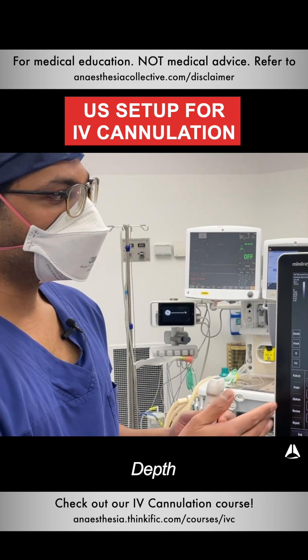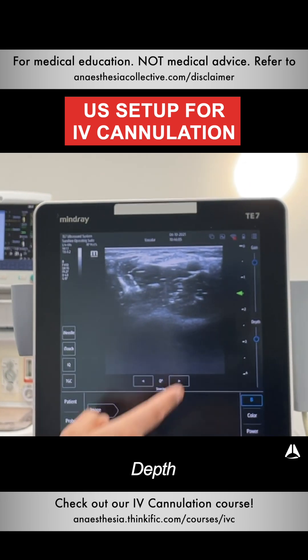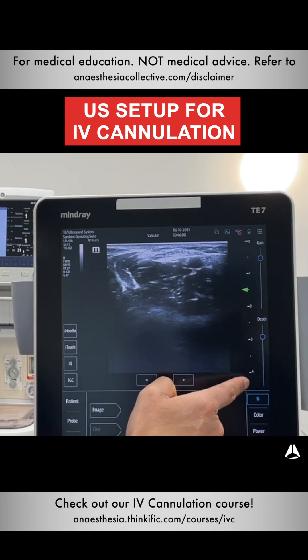The next thing is depth. What you see is a number of different markings on the side — these are centimeter markings. So this depth is about four centimeters.